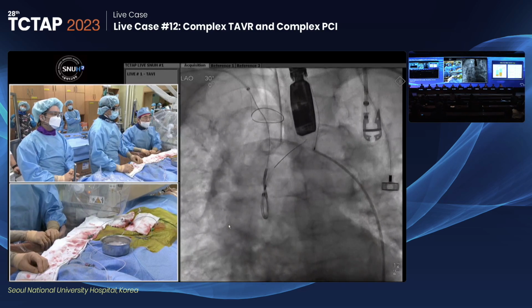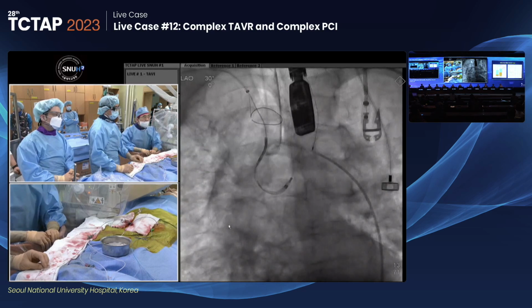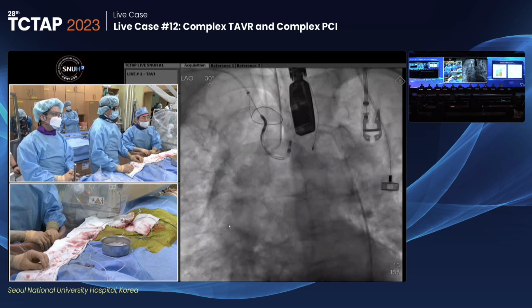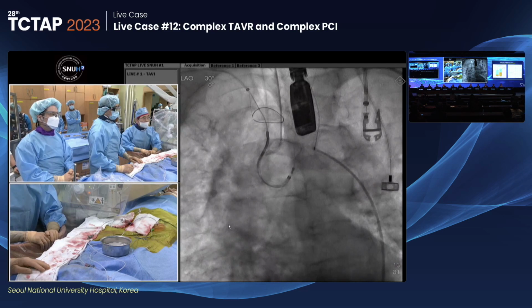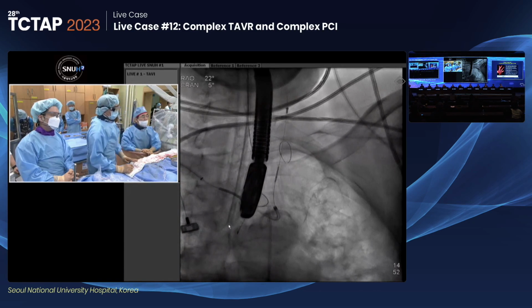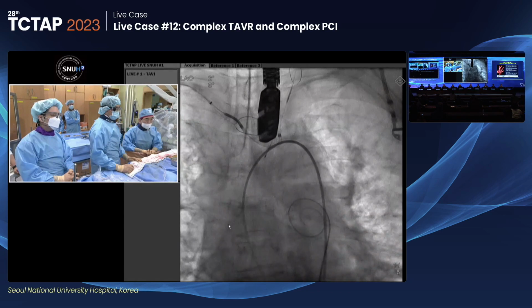With manipulation of the articulation part, plus. We introduced the wire into the left common carotid artery and then retrieved the whole system to make contact of the articulation part and the bifurcation between the brachiocephalic trunk and left common carotid artery, plus. We deployed the distal filter. Then we show the double tracing pressure profile. As you can see, the pressure profile.